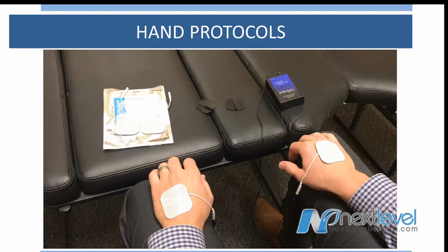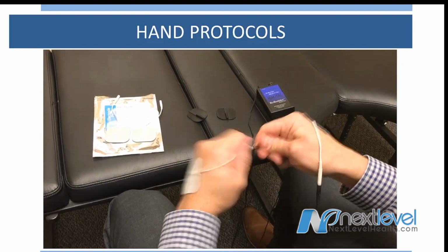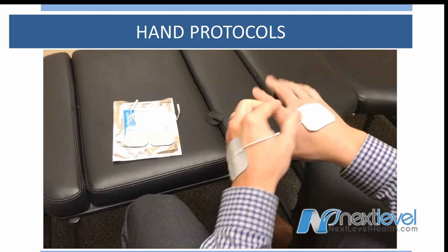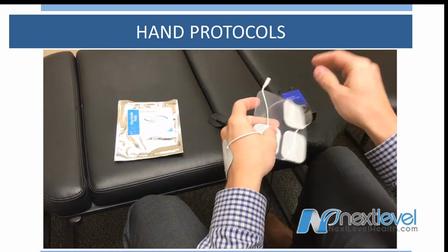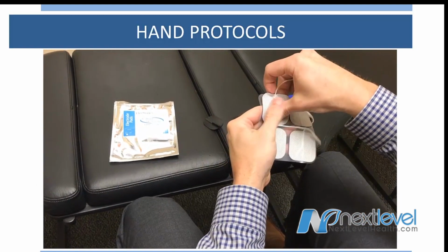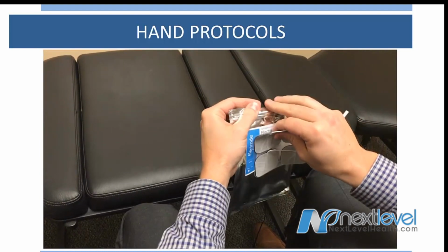Then you're going to unplug each of the sticky pads. Then you're going to peel each sticky pad off of your hand and put it back on the plastic that you pulled it off of. Then put that piece of plastic back into the silver pouch and seal it shut.